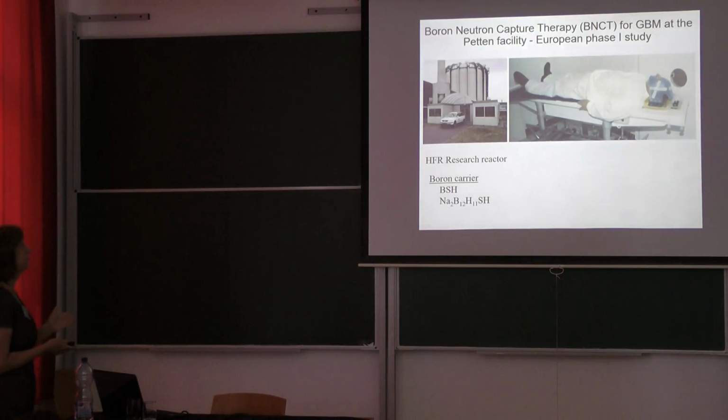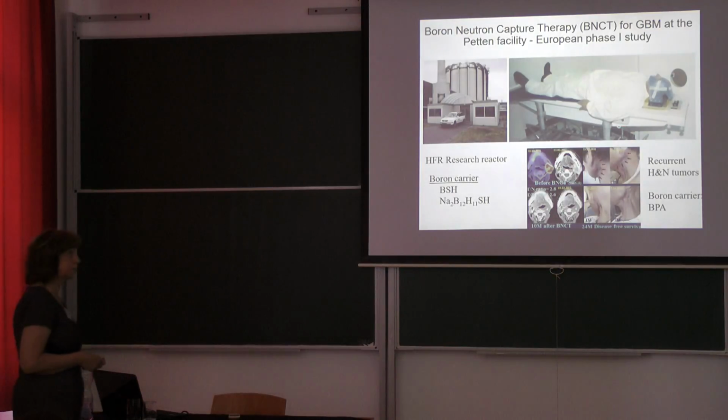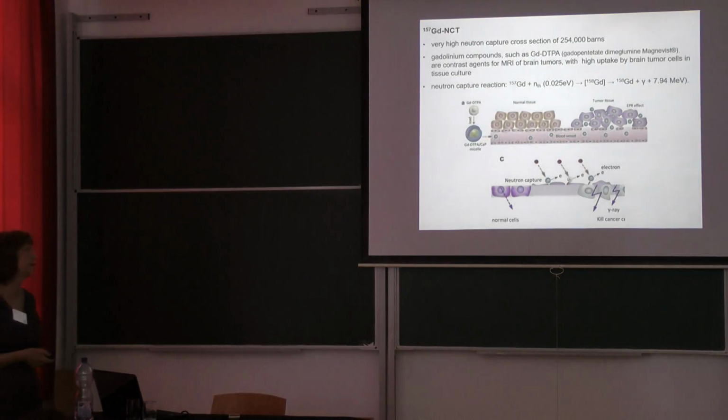But nevertheless, there are some phase 1 studies which have been performed in the Netherlands and in the US in a common effort, and recently in Japan there are several centers where they still perform BNCT now, and they have published some promising results with recurrent head and neck cancer irradiation, as well as publications from Finland, from Helsinki.